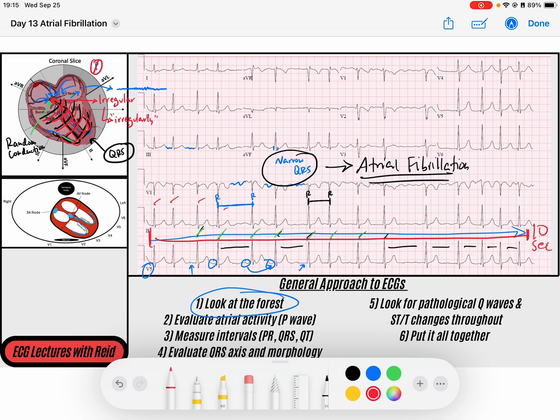One, two, three, four, five, six, seven, eight, nine, 10, 11, 12, 13, 14, 15. If I know that 15 QRS complexes occur in a 10 second period, well, in a 60 second period or beats per minute, we will multiply that by six. So six times 15, I got to do math on camera. I think that this is six times five is 30, 60, 90 beats per minute. If I'm wrong, you guys probably get the gist, but six times 15, 90 beats per minute.